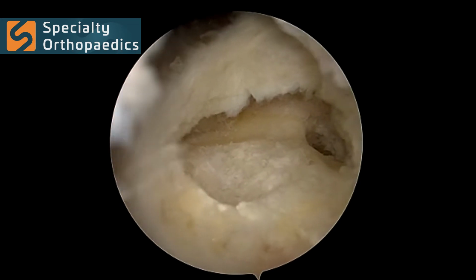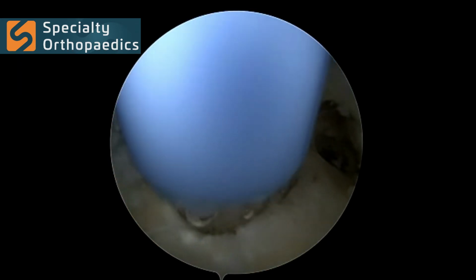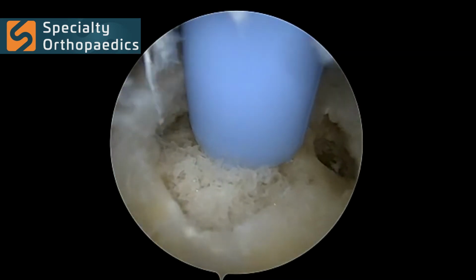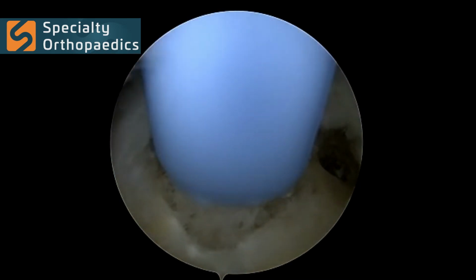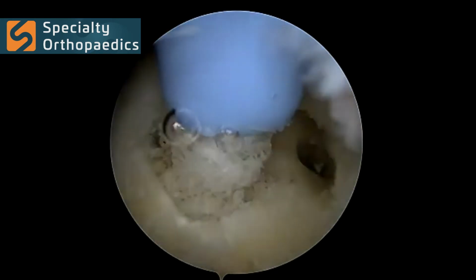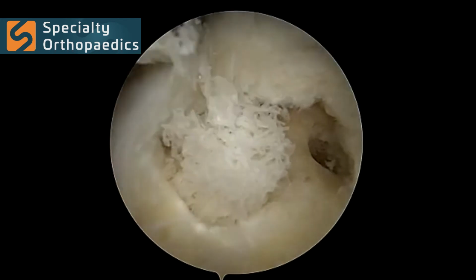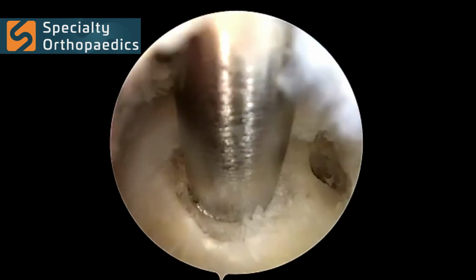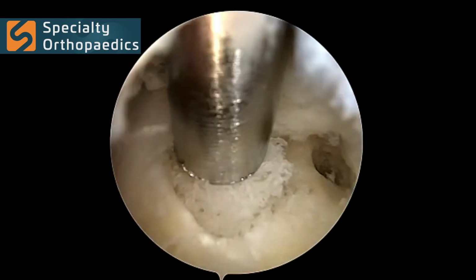Upon impaction of the bone graft, we then proceed with further filling the lesion, inserting more bone graft into the site. This is done to fill the cyst and make the graft flush with the surrounding bone. We then proceed with inserting the bone tamp once again to further impact the graft within the cyst.